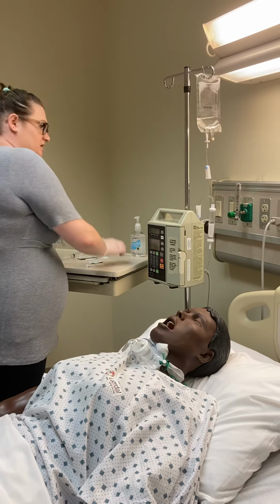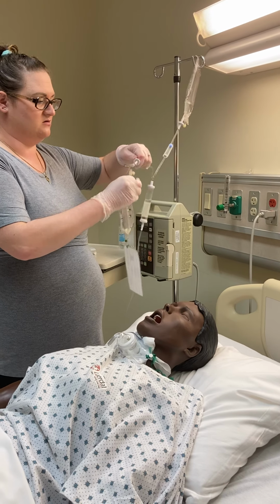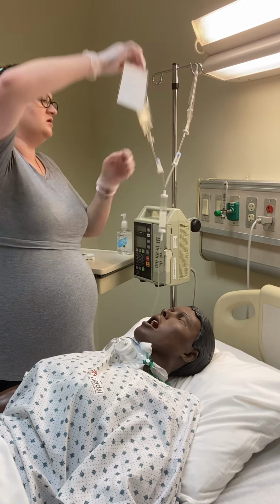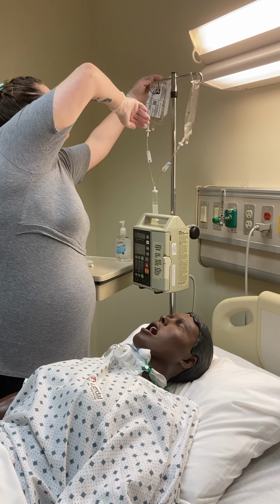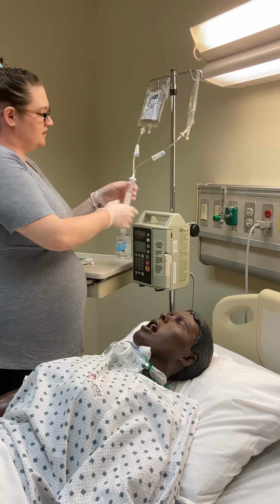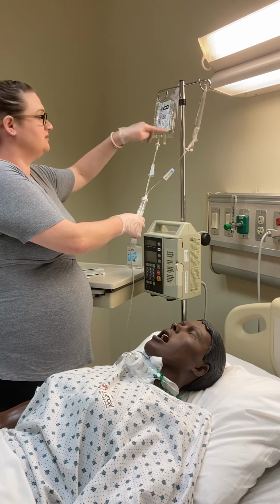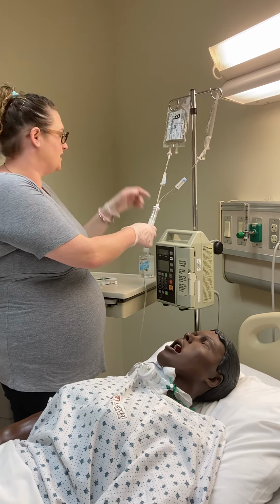And what I'm going to do is spike a second tubing with my blood and put it up here, and then I'm going to open my clamp. And again, saline is closed, because if I open the saline at the same time, the blood's going to back up into the saline, and then you've got ruined product.